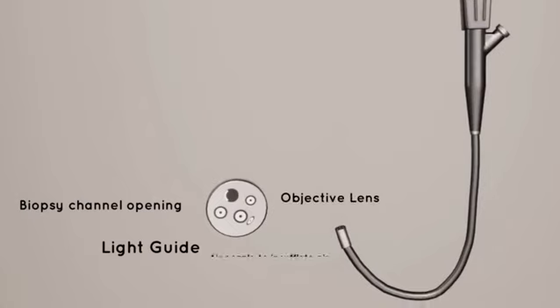4. Air nozzle to insufflate air. 5. Water nozzle to clear the lens. 6. Water jet nozzle. Water introduced with a syringe through the forward water jet connector comes to this port and gives a more powerful blast of water.